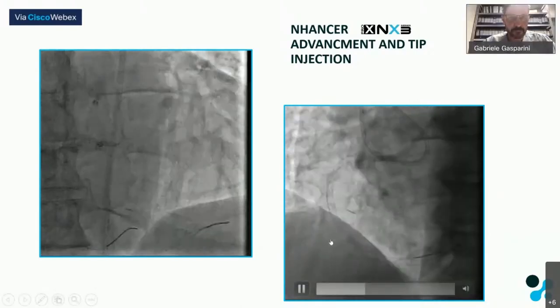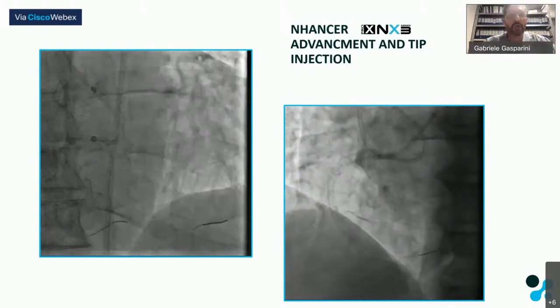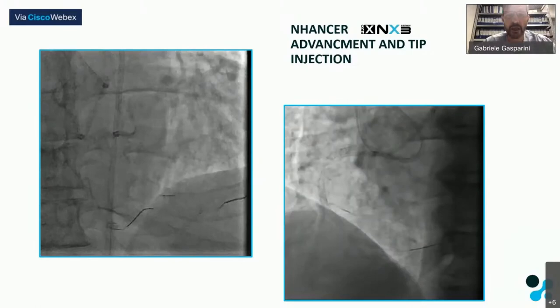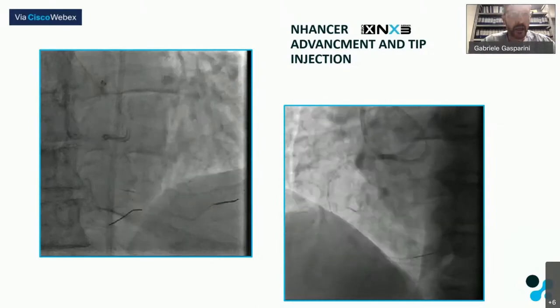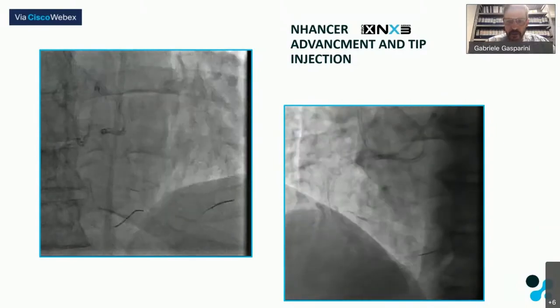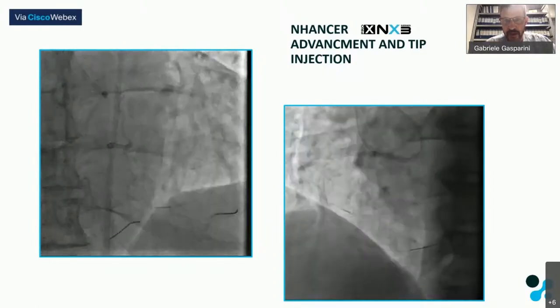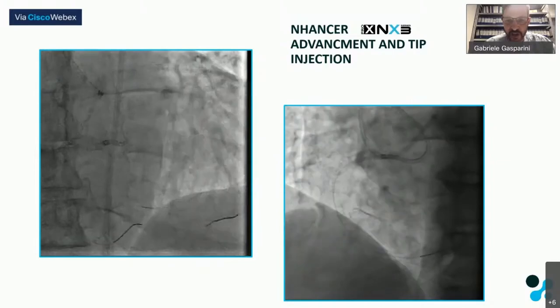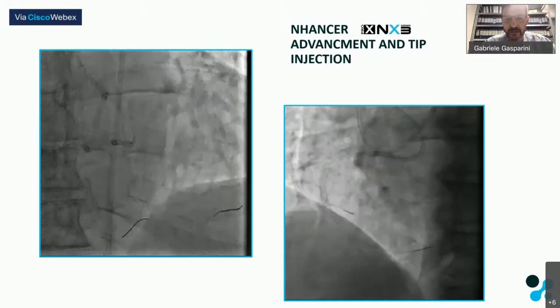Yeah, and then this is Gabriele. Yeah, we have a question that could be interesting at this moment, from Hafsaneh Mohammadi. She wants to know the difference between the Enhancer Pro-X and the Caravel. So I think the most important difference is the tip penetration power of the Enhancer Pro-X. It's higher compared to the Caravel. So the tip of the Caravel is quite fragile. And I would like to know your opinion, Roberto, and if you can explain other differences between these two devices.